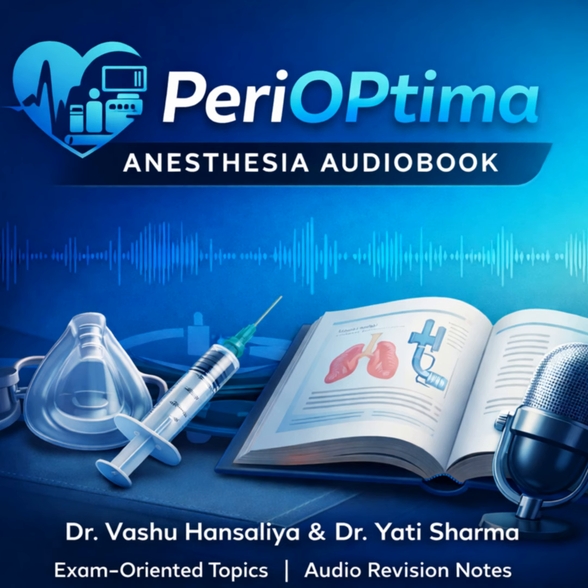Got it. Bedside, binary, clinician-led. Okay. Now, I feel like I need to give this some historical weight. Anesthesia wasn't always like this. We used to be the specialty of blind faith. Or blind poking, if we're being honest. Kaushik Jyothanath has this great section on the evolution of regional anesthesia. You need to map that journey to show you understand the context. We started with paresthesia, which is basically poking a needle around until the patient screams, "Ow, my arm!" And then we say, "Great, I found the nerve," and inject. Effective, but barbaric. And potentially damaging.